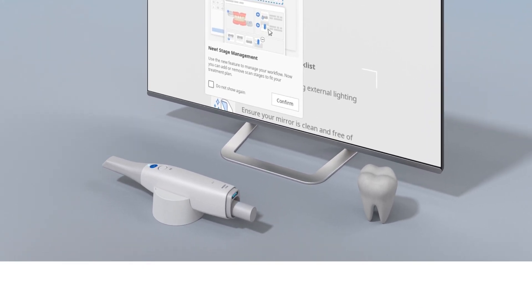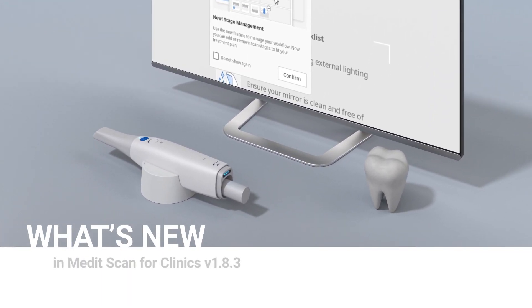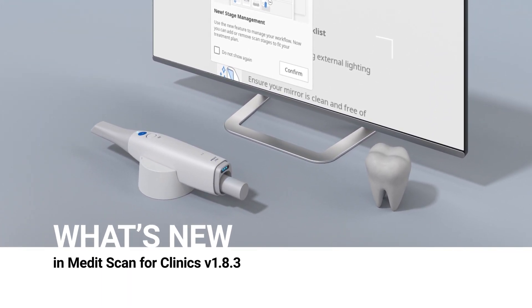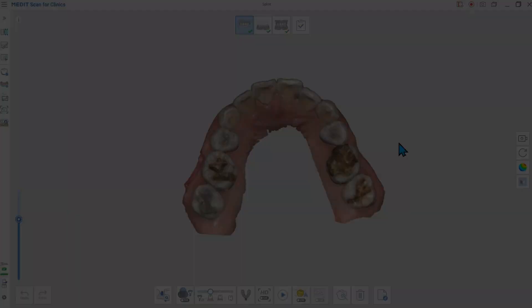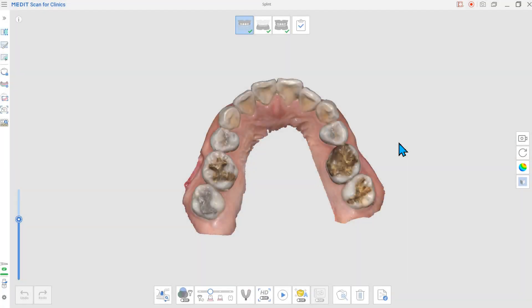We'd like to introduce to you the updated Medit Scan for Clinics. This version's big and exciting update is the new stage management feature.